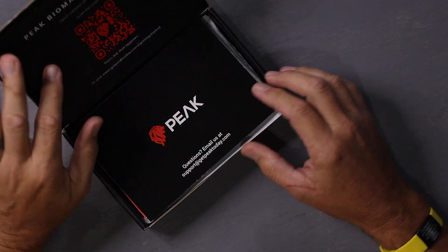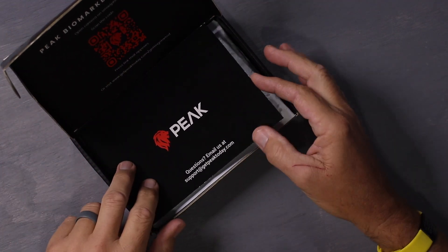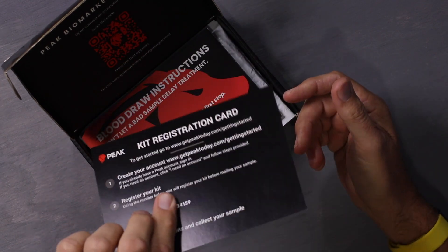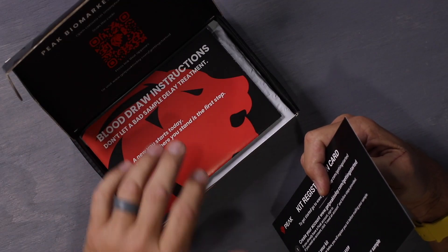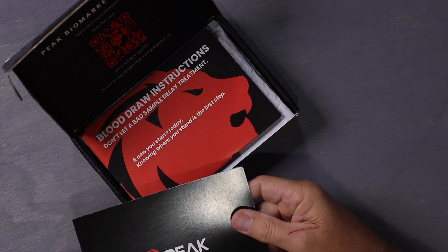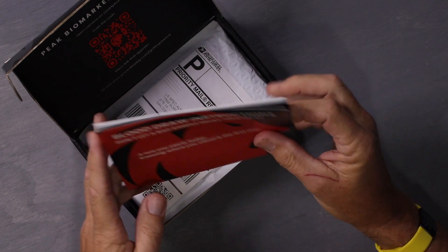So let's follow along. When you open up the kit after you order it, there's going to be a kit number that you're going to want to register online, to let them know that you received it, and then everything that is sent back will be with your name attached to it.